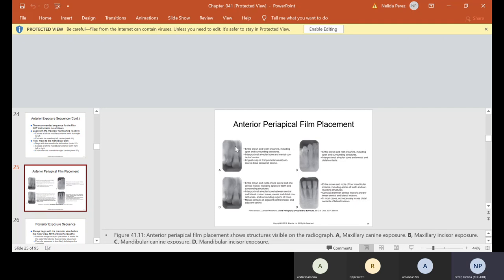Letter B shows an incisor — the entire crown and roots of one lateral and one central incisor, including the apexes and surrounding structures. You can see the interproximal alveolar bone between central and lateral contact areas, and the mesial and distal contact areas. The most important thing to remember on any periapical is don't cut off the crowns and make sure you get the apex. Letters C and D show the lower anterior — the top faces down and the bottom should have the crown facing up. C is a mandibular canine exposure and D is a mandibular incisor exposure.